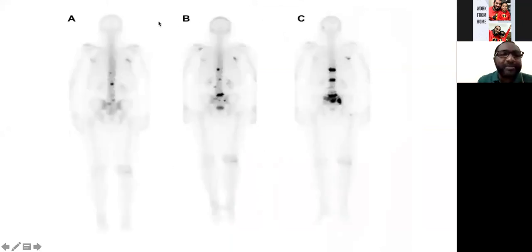This is an example of a patient with breast cancer. If you see, this is the anterior, and this is the posterior projection of the patient. I'm just using the posterior projection at the initial time of diagnosis. So this is her staging scan.